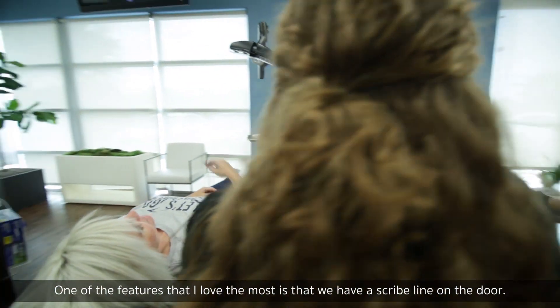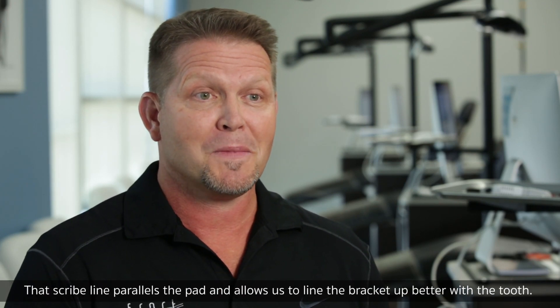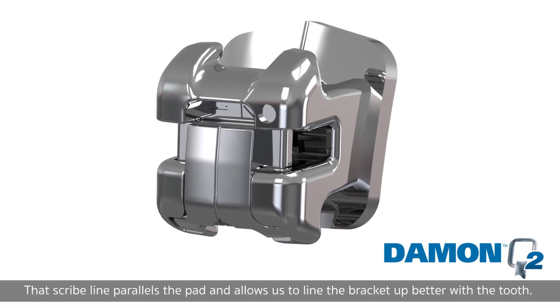One of the features that I love the most is that we have a scribe line on the door. That scribe line parallels the pad and allows us to line the bracket up better with the tooth.